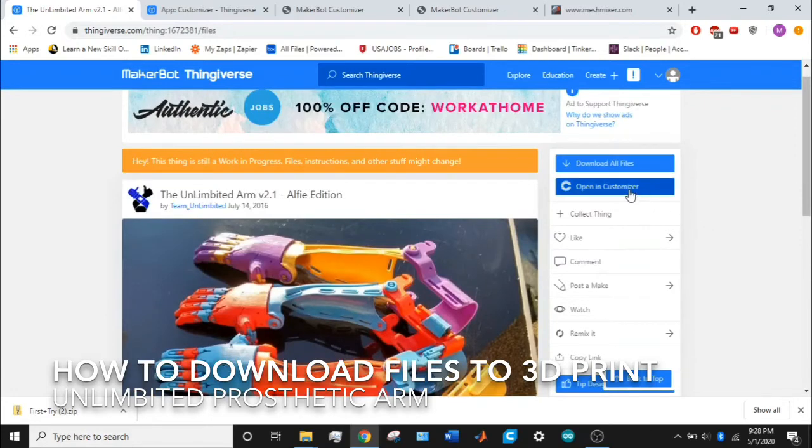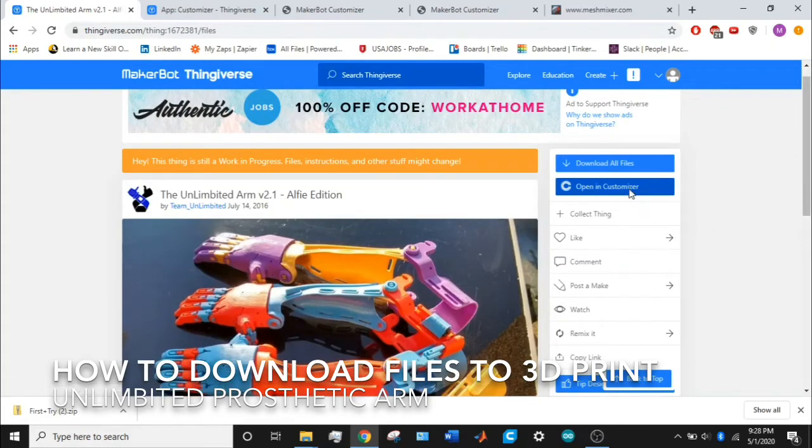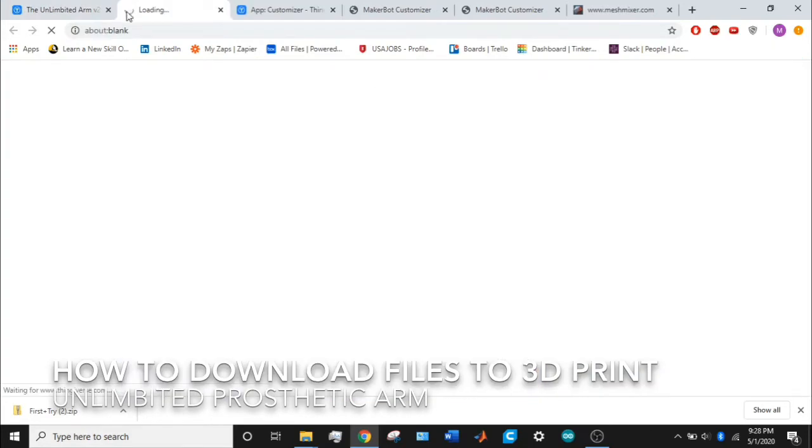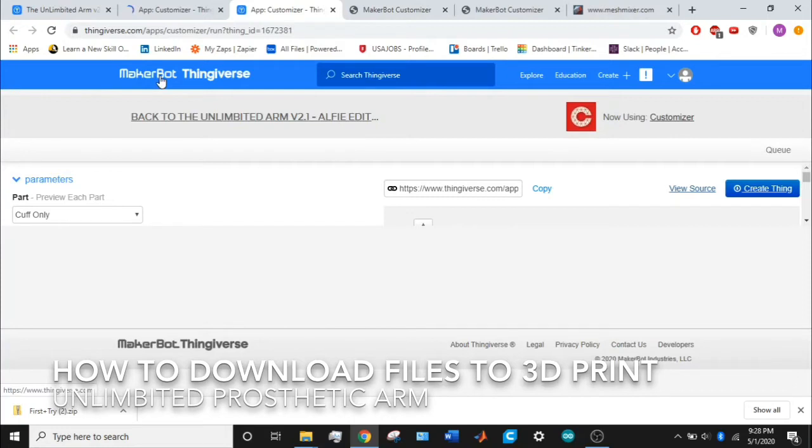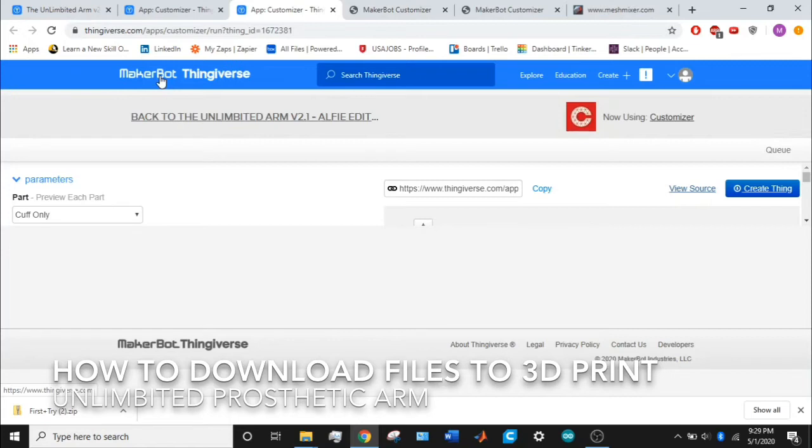What I suggest you do is go on opening customizer. Once you do that, it'll take you to this screen. If you don't have a MakerBot account, it might prompt you to type in your email or password or create a MakerBot account. It's a free account, so it's easy to do.